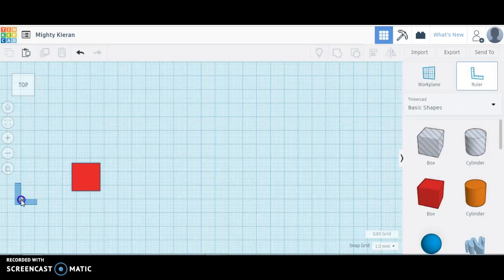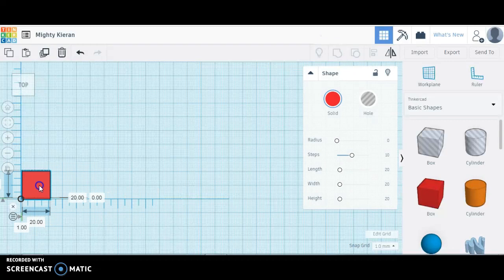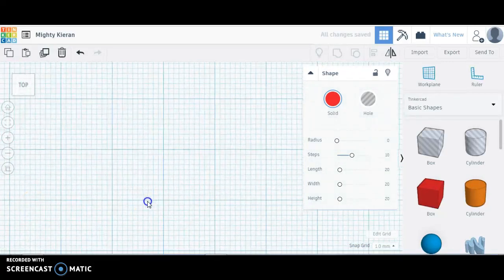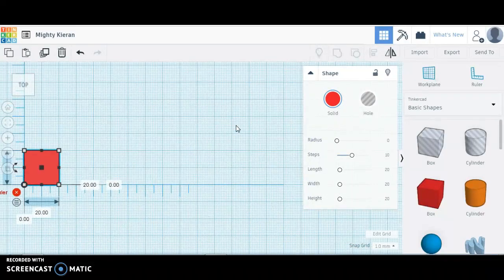I'm going to drop a ruler at one of the main grid lines and drag my box over to that center of the ruler. I could zoom in there also just to see that things are centered up.